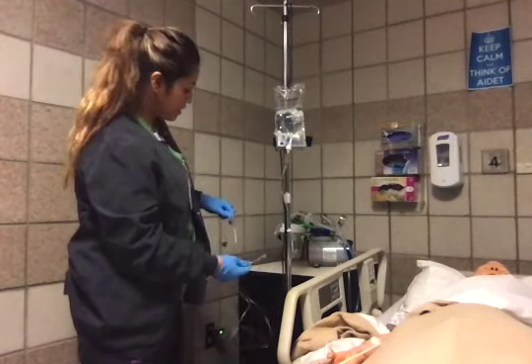Now this time I am not going to fill the chamber, but I'm going to use what they call the backflow. So I'm going to fill my chamber with the saline. I'm going to need my alcohol wipe. I'm going to wipe both ports and connect them.